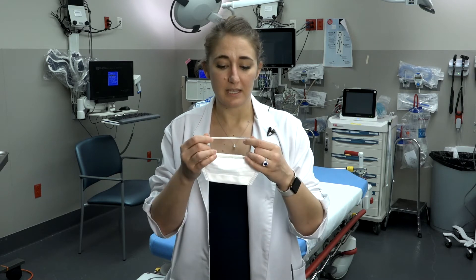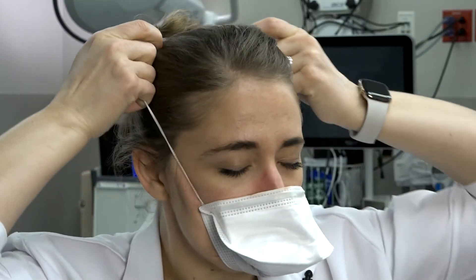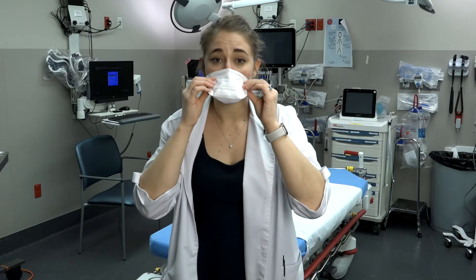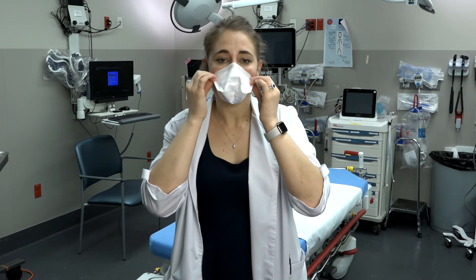When placing the respirator on, you will separate the head loops, place the mask under your chin and over your nose, pulling the straps over your head so that one strap is above your ears and the other strap is below. Then secure the mask to your face so that there is a good seal, not allowing any air through it, which you can detect as you inhale and exhale.